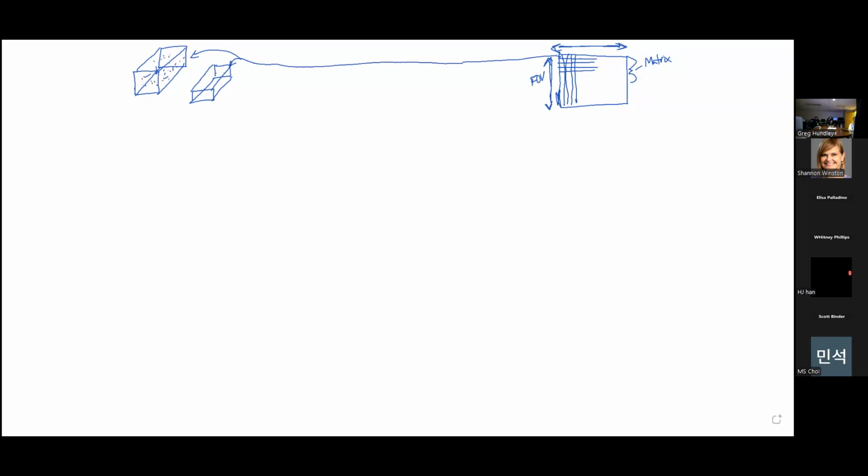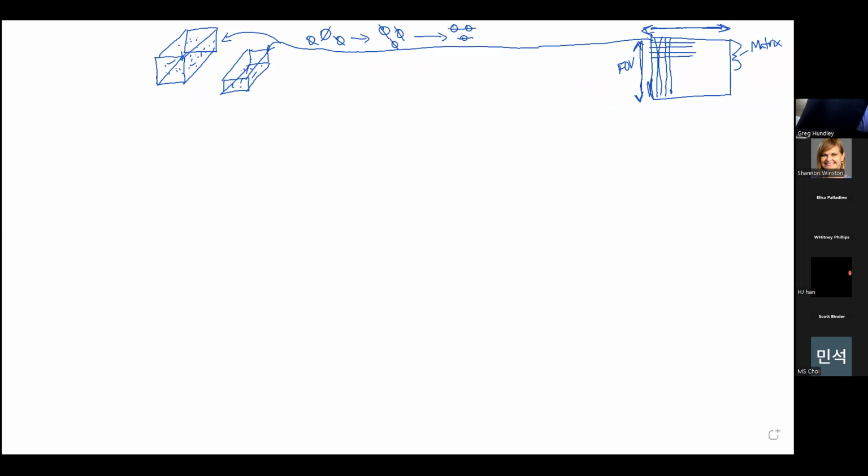Remember, outside of the magnet, the protons were spinning in random fashion, and then in the magnet, they align all their spins. Dr. Jordan talked a little bit about this too. And then we pass the FM radio wave into the target so that the protons tip their spins.